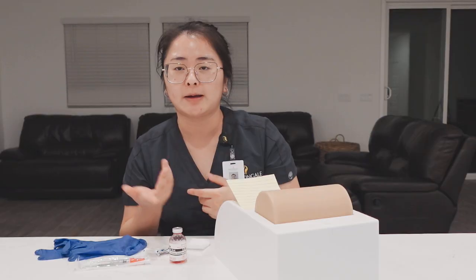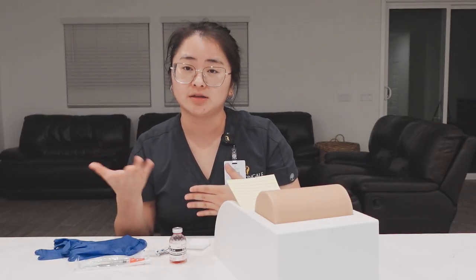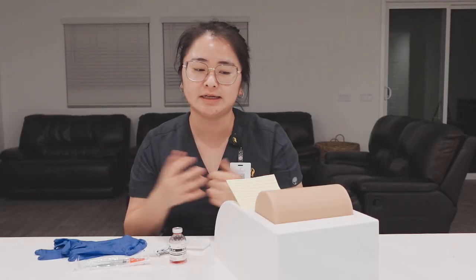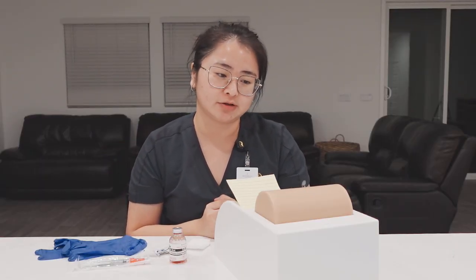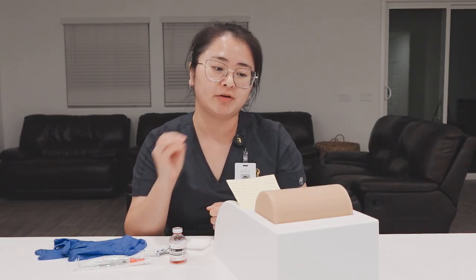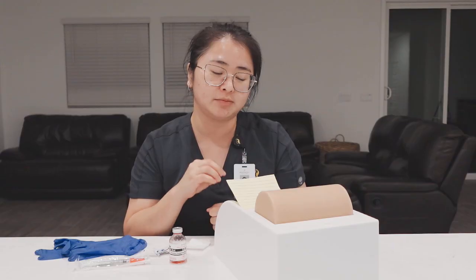This is where I would check the medication against the MAR for a second time. So second time out of 3 times. And we may proceed. Okay, Mr. Smith, you've been prescribed heparin, and what heparin is, it is a blood thinner. It is supposed to prevent blood clots in your blood vessels.